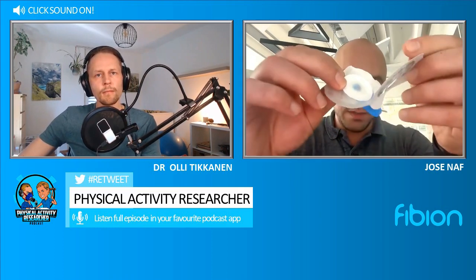So if we then go for the electrodes for ECG and HRV measurement, what are the main types that are currently available in the market, and what are the differences between the different types? So currently there are three main types which are well known. The first one is the wet gel electrode. And wet gel is maybe 60, 70 years old. It was one of the first gels which was developed. For example, there's one very famous one, which is the Ambu.